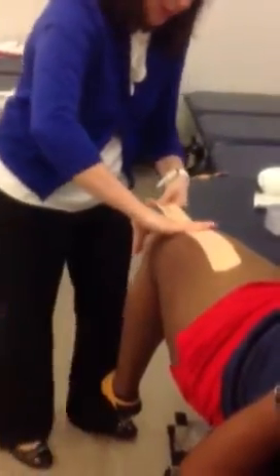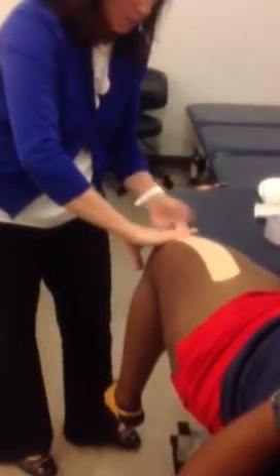So what I'm going to do is I'm going to pull down, and then I'm going to just kind of free up my tails here. So I'm going to come down — whether it's typically rectus femoris — I'm going to lay it down. Now I have my tails.